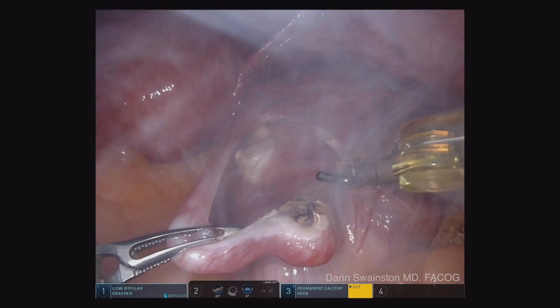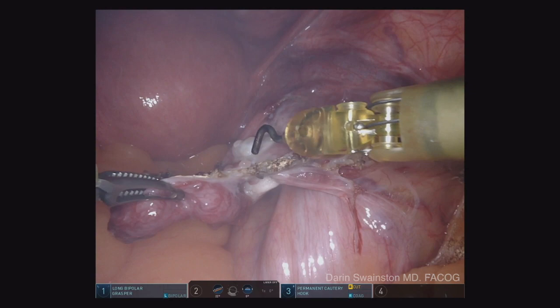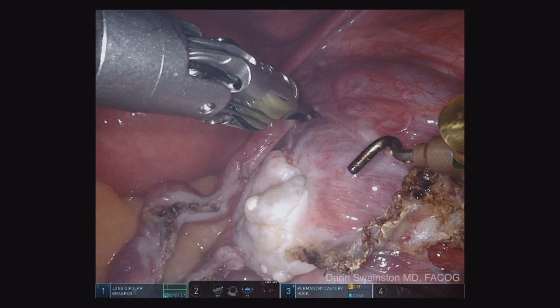I start in the middle and I use the bipolar energy. I try to minimize the amount of cautery I use, and I go ahead and march it down toward the fimbriated end, taking the entire fallopian tube off the ovary and back the other way.